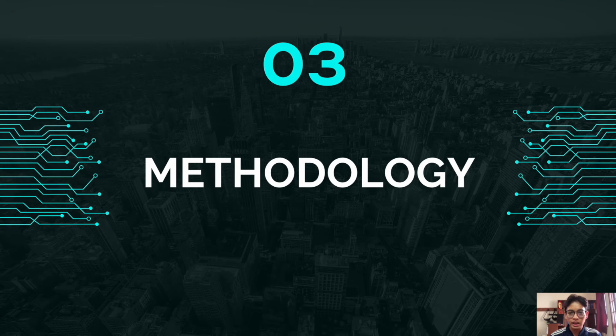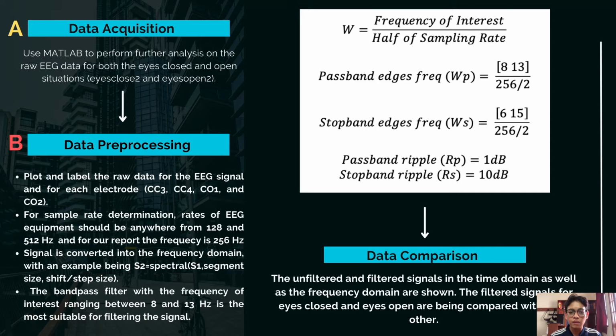Hi, my name is Kobir and I will be presenting the methodology and the results of our report. Firstly, for the methodology, our first step is to handle the acquisition of the EEG data, in which we use MATLAB to perform further analysis on the raw EEG data for both the eyes closed and eyes open situations.